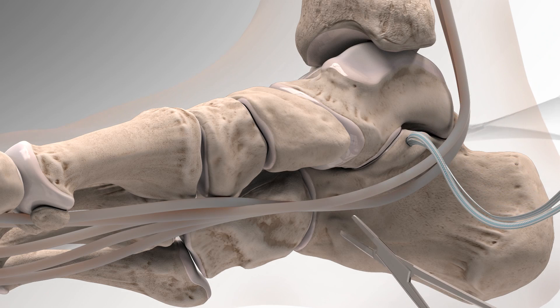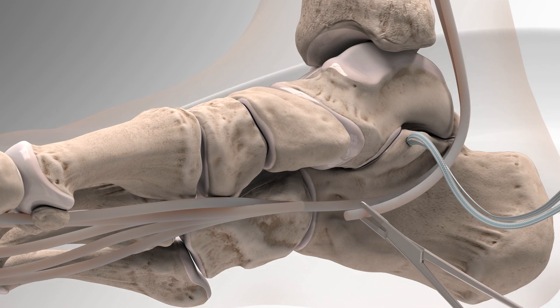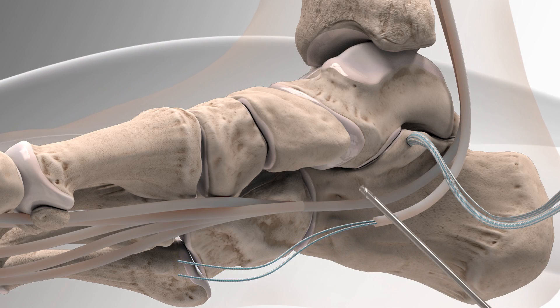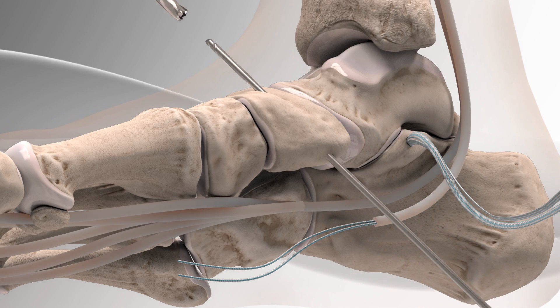Next, the FDL tendon, also known as flexor digitorum longus, located on the medial side of the leg, is identified, cut, and then tagged with a fiber loop stitching technique. A bone tunnel is then made in the navicular to prepare for an additional swivel lock anchor.